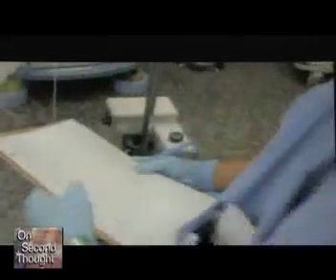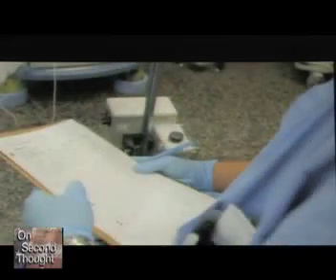You'll notice here, this is a chart. The anesthesiologist writes down everything that happens, as diligently as you are doing here. The anesthesiologist is recording all of the blood pressures every 5 minutes. The pulse oximetry, the carbon dioxide, the rate that the patient is breathing gets recorded usually every 15 minutes. The heart rate, the heart rhythm, what the EKG looks like, is being recorded.